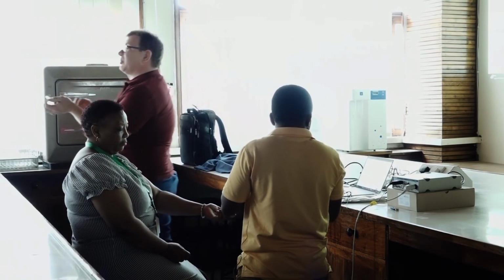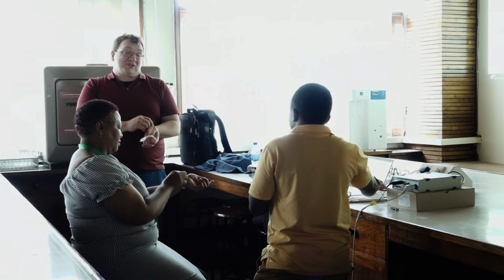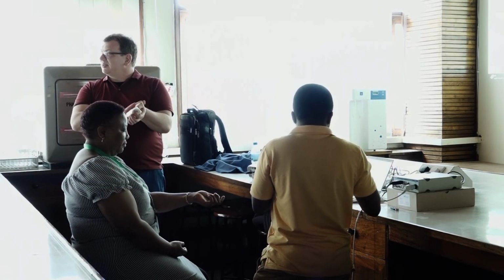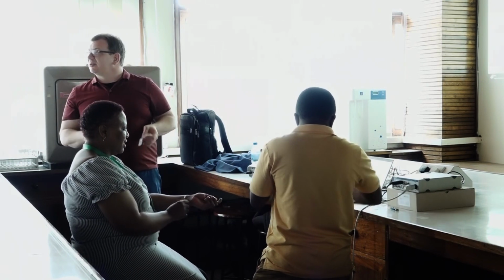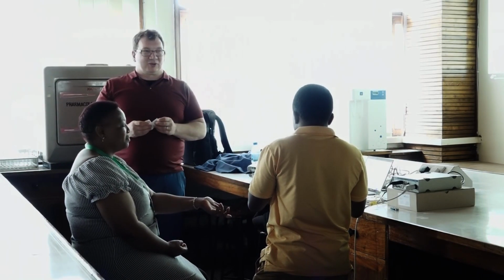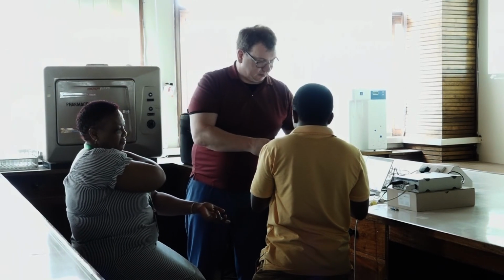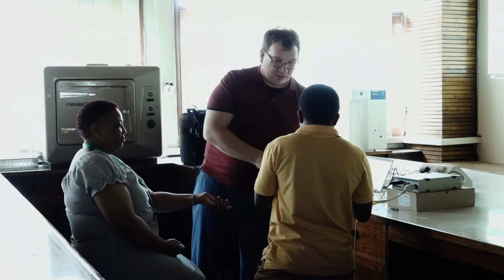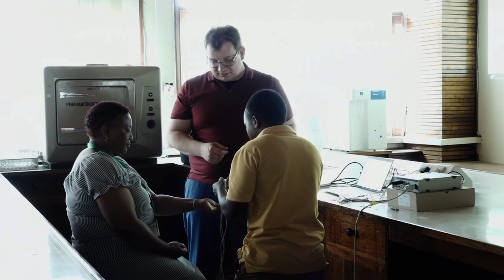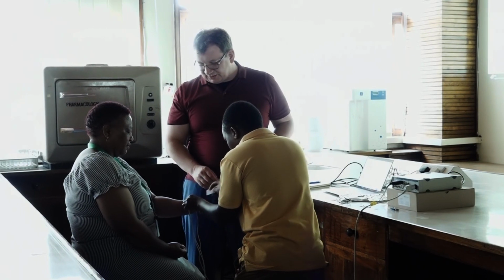Sometimes when people wear watches or metal things, we could keep it on and see if it makes a difference. Sometimes it makes a difference if there is a metal item, like a watch, on the wrist. Okay. Just there. Perfect.